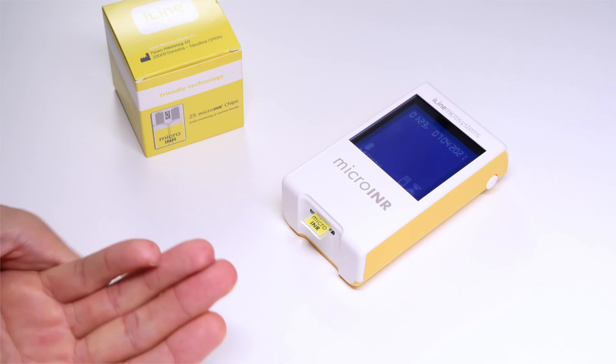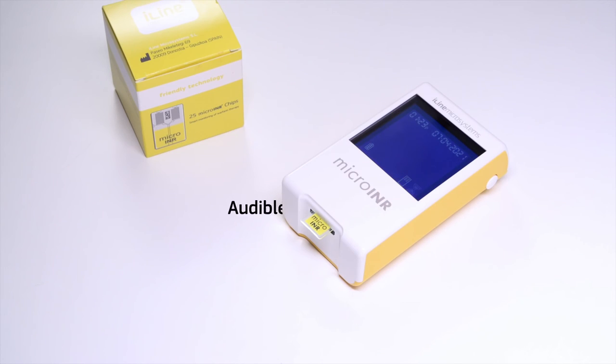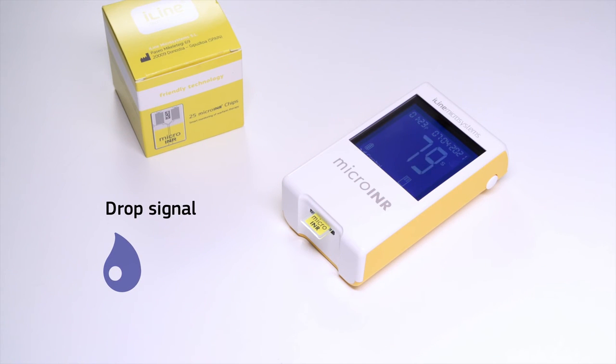Wait for the meter to be ready while preparing your hands for the finger stick — make sure your hand is warm and massage the finger softly. The meter is ready when it emits an audible signal: the drop symbol begins to flash on the display, an 80-second countdown appears, and the chip emits a steady light. Do not finger stick until the 80-second countdown starts.